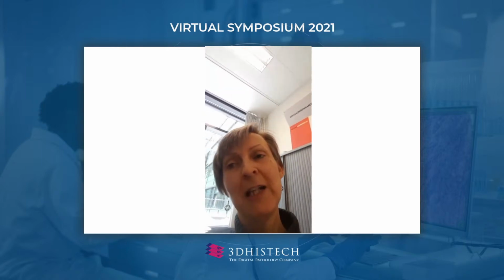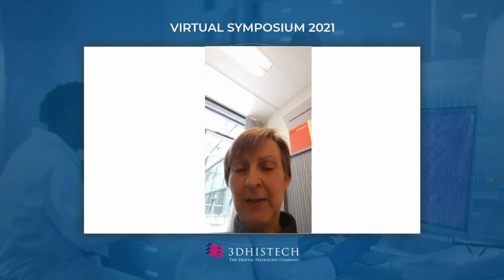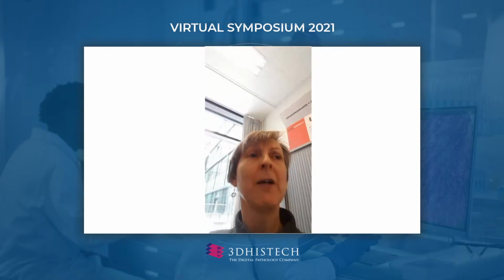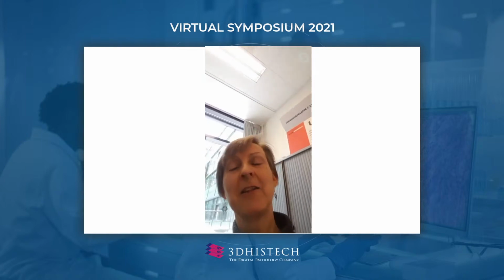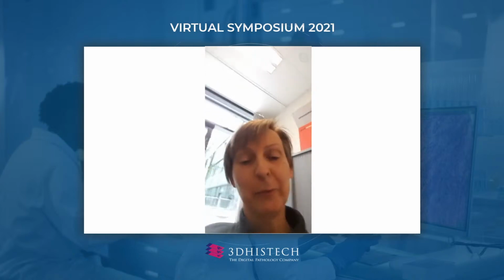But since we are trying to make a really continuous flow, in fact, I think the turnaround time is even a little bit faster, because otherwise the slides were waiting in the lab until 12 o'clock in the day, and then a technician went around the department to give every pathologist a pile. But now, as soon as it's scanned, you can already have a look at it.